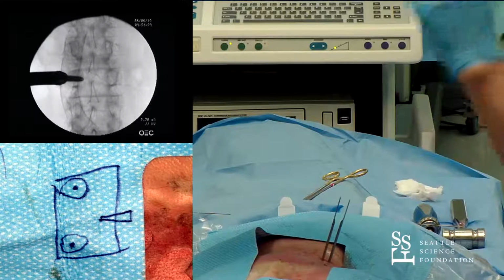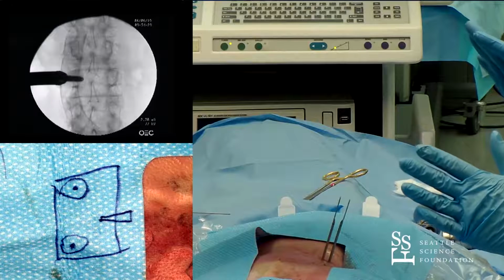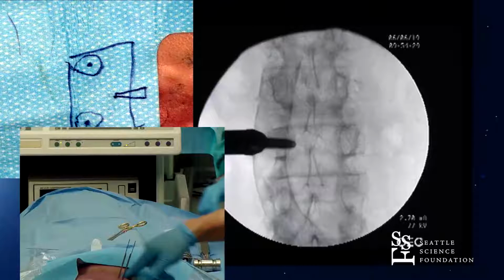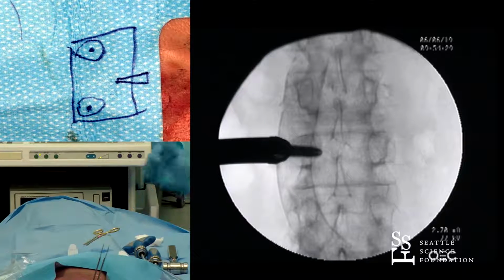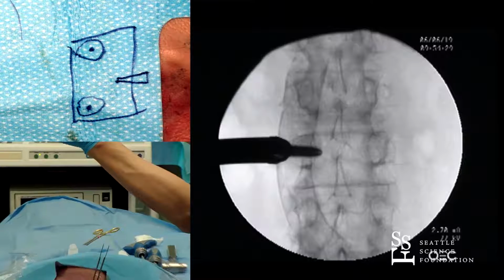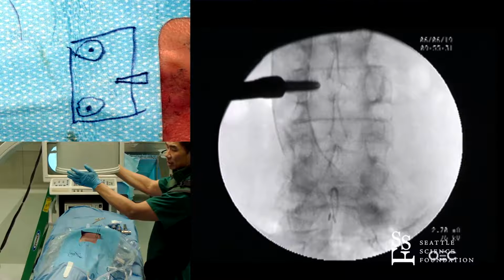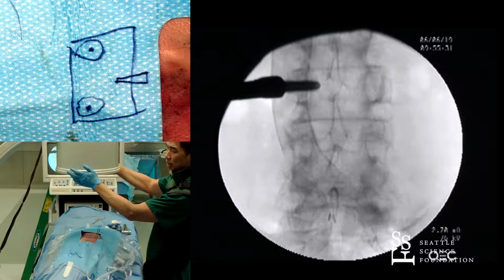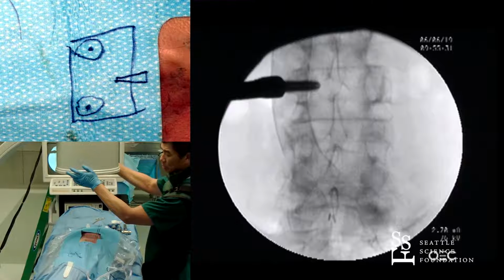I like that image up there. See if you can hold on one second. You probably are going to be better off. Actually, that's not bad. That's really not bad. Maybe you can just give me the wigwag. Okay, that's perfect. Give me the wigwag. It's going to be slight. Right there. It's good. That's enough. Let's see what that looks like. I don't really like it. Let me see Ferguson a little bit. Give me the wigwag one more time. Try to make it easy.